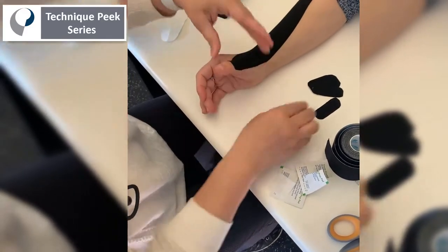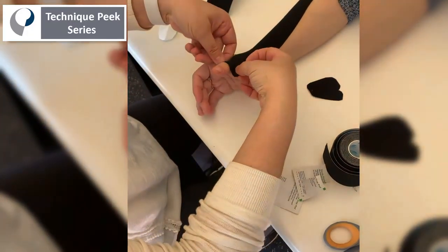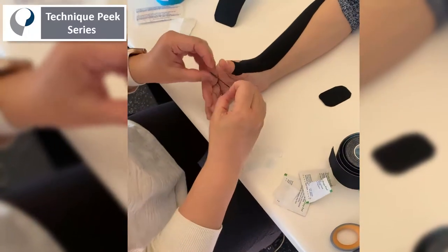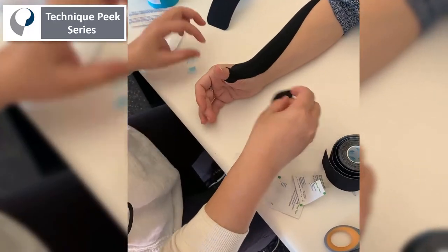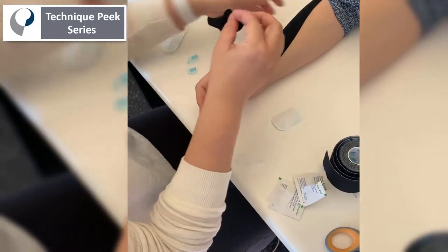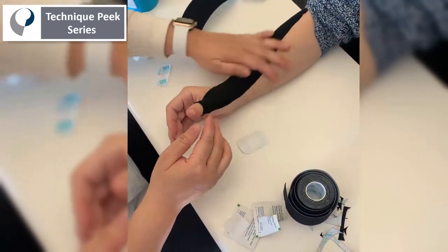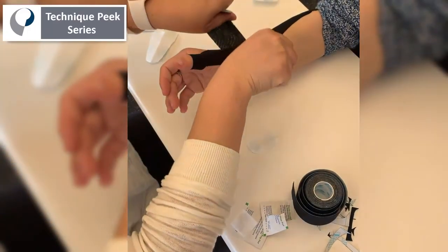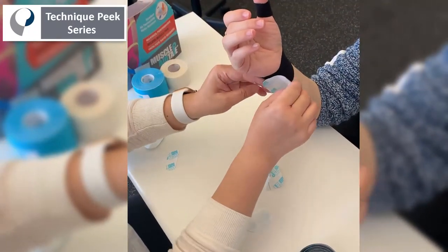After that is done, take small pieces to tape down the distal and the proximal end of the tape — two thin ones for the distal end and one for the proximal end. Where the pain is, add a hundred percent pull over the radial wrist where the patient tells you it hurts the most. The rounded edges are laid down flat and you overlap.